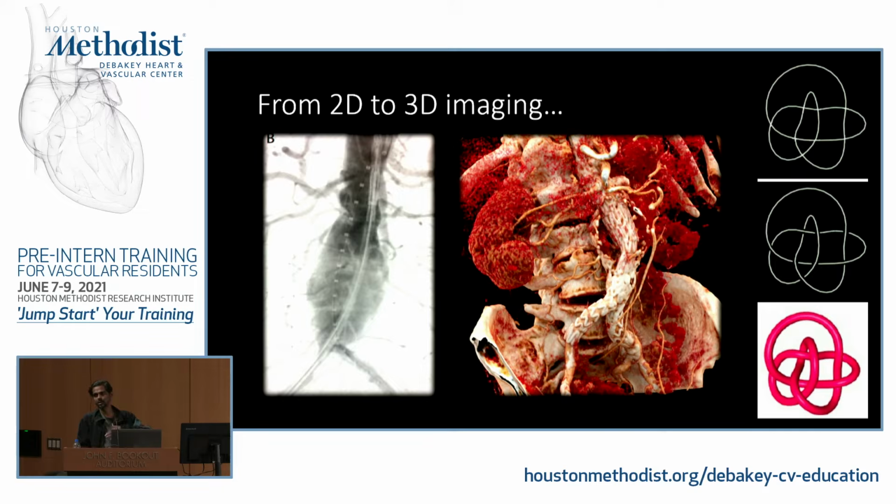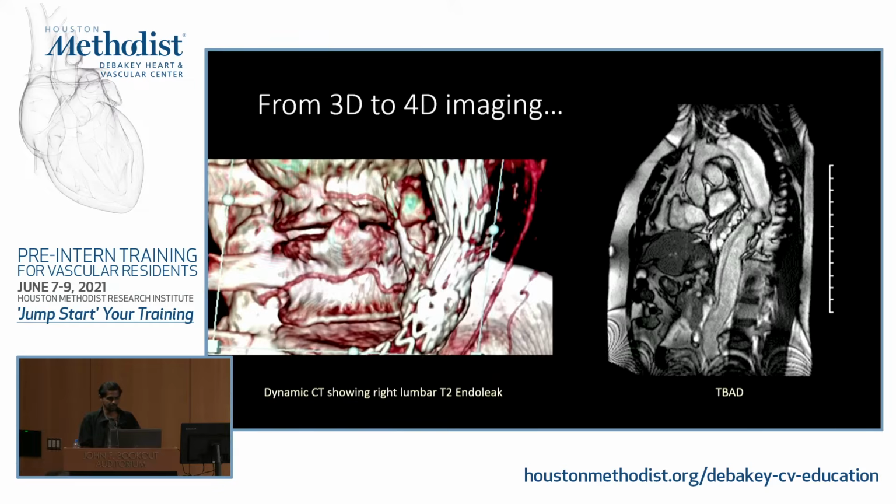do another oblique shot. And that definitely, the more and more oblique angiograms you do, you add up to radiation and contrast load. And that is precisely what we try to mitigate by doing the CT. So the CT gives you that three-dimensional picture, but the key is, what is the missing link? How do we get the information from CT and have it available when we do our angiogram? So that's kind of what we'll touch upon later.